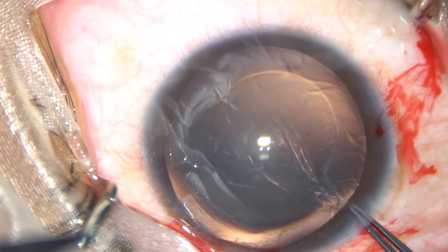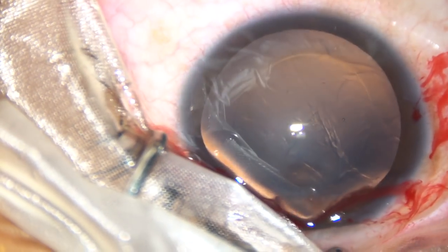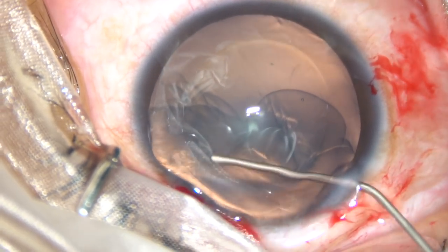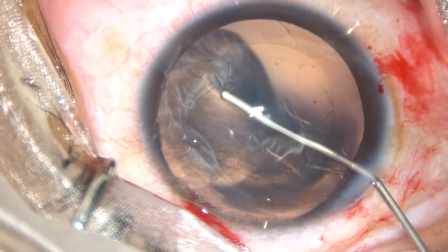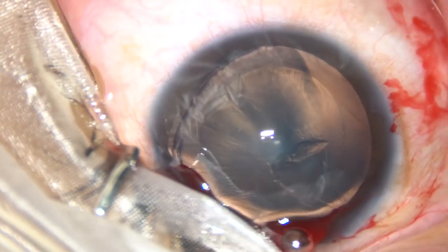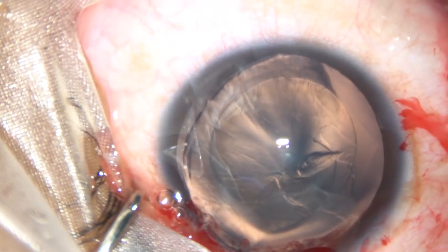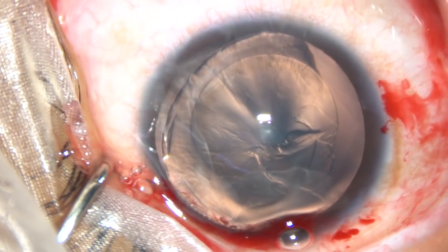The patient is a 22-year-old lady and we have planned monovision for her. This eye is targeted emmetropic and the other eye myopic. Hydrodissection has been done. And now some visco is injected into the anterior chamber. Now see how we can remove this clear lens.